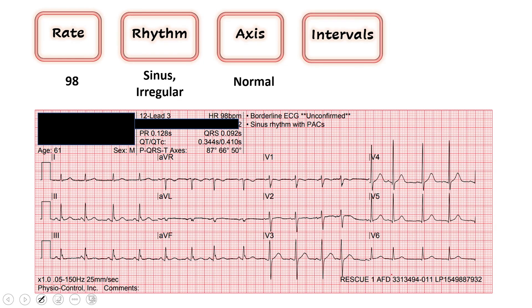Next we're going to look at our intervals. The two we're most concerned about are our QRS and our QTc. Again, we let the computer do the work here. The QRS is 92 — that's less than 120, very happy with that number. And our QTc is 410 — that's less than 450. So I would call our intervals normal here.